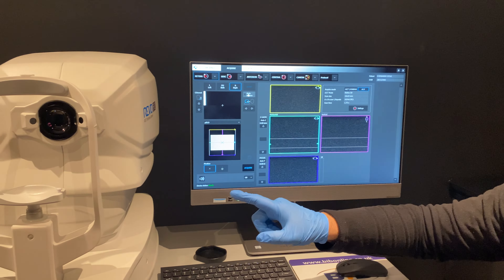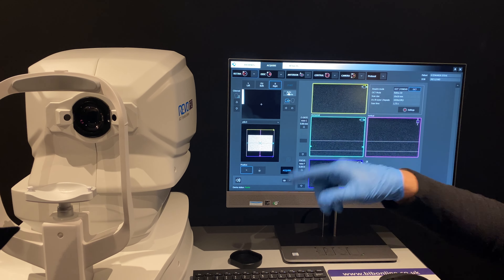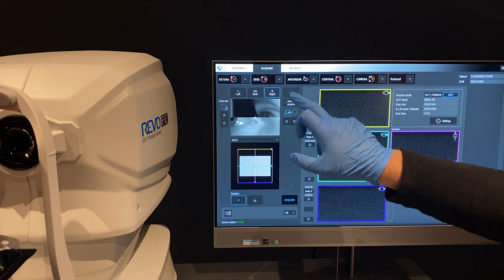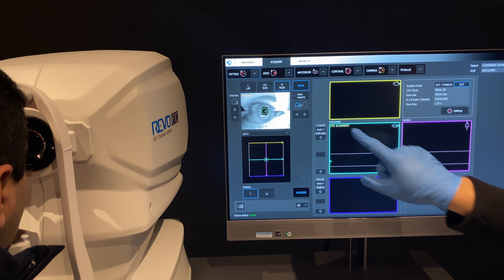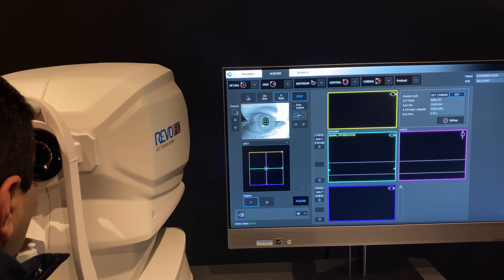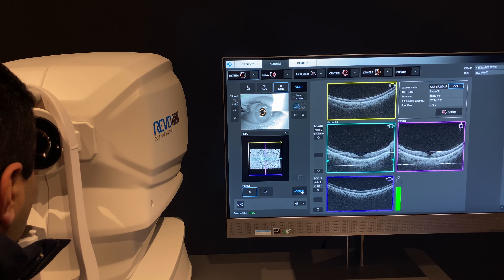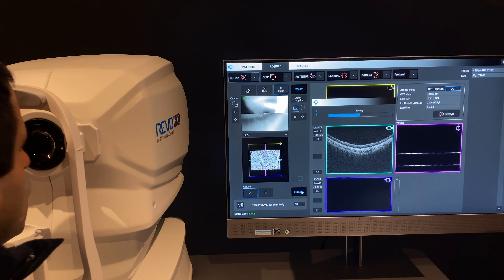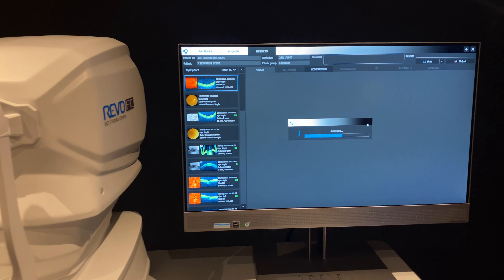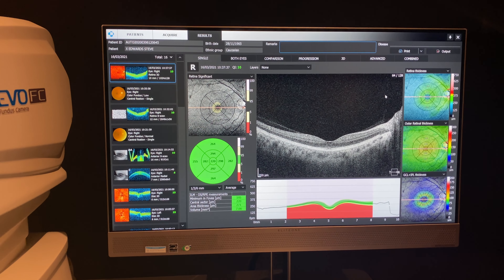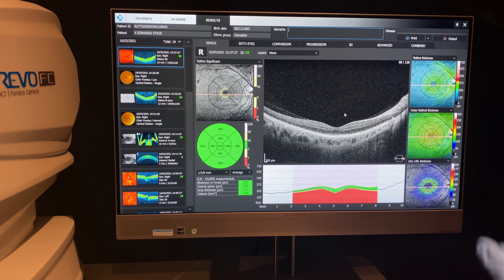If we go back to retina — are you right to do another image? The more scans you do, the better you're going to get. Pop your chin back on. I've switched to auto and I'm going to press start. I'll wait to see the retina appear and 'ready' to appear — when it does I can click acquire. Give me two blinks and then eyes nice and wide. Okay, sit back and relax. We're just rolling through that image. Semi-auto is not difficult to do.